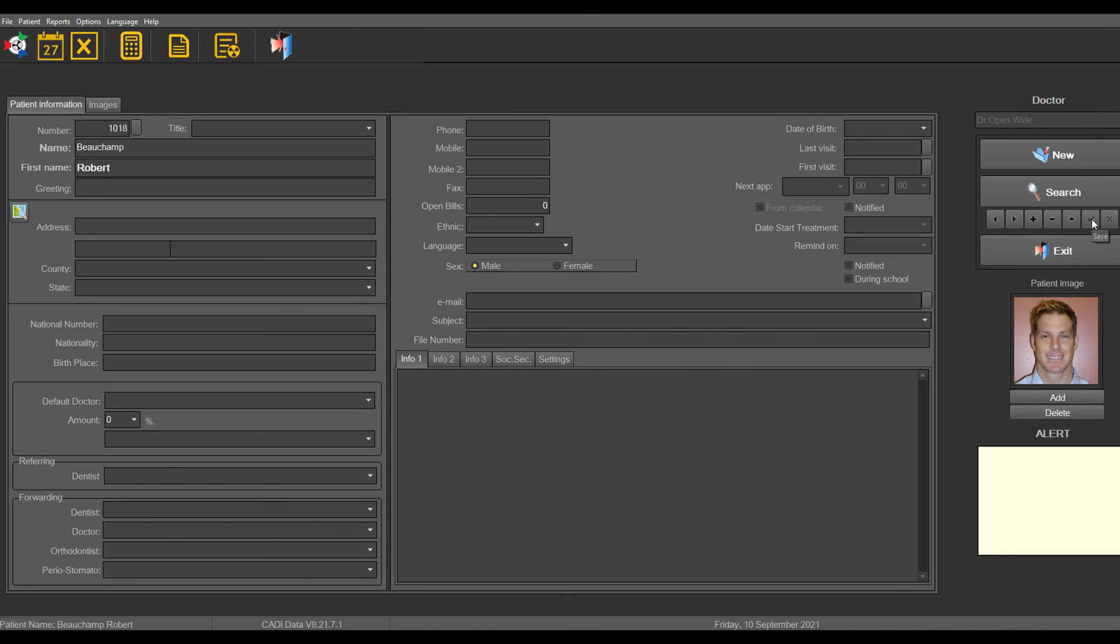And that's basically how you add a picture into the CADDI data main screen. Thank you.